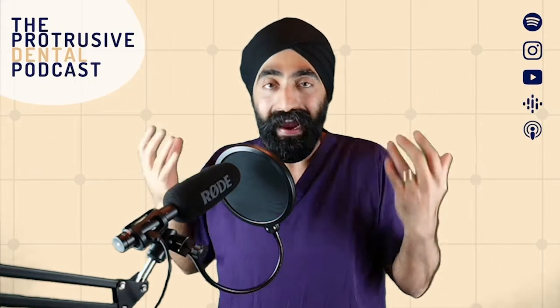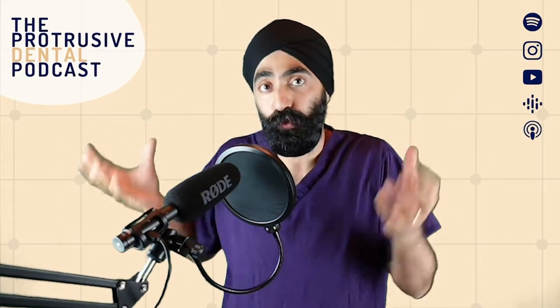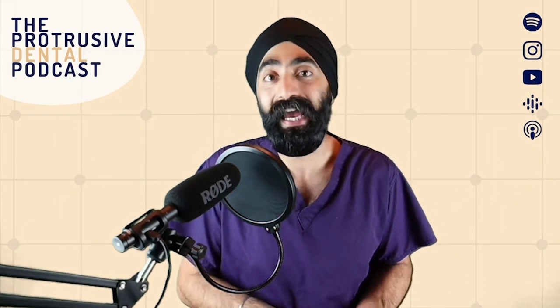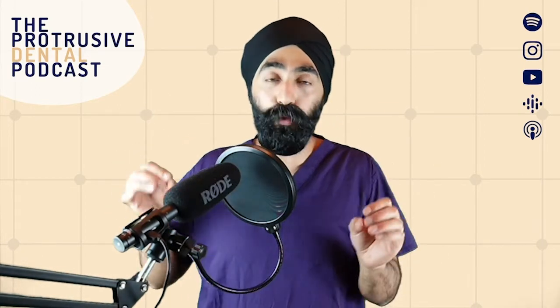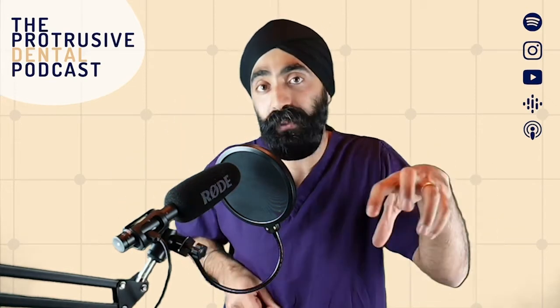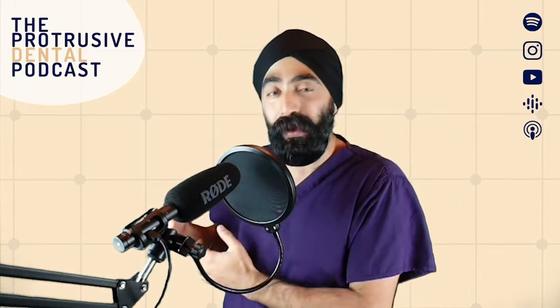Okay, so how can we make sure that this is as reliable and as predictable as possible? Well, that's why we use articulators, right? So we use articulators to mimic the TMJ and mimic the upper jaw and the lower jaw and the movement. So that's essentially why we use articulators, but we know that the best articulator is the TMJ. So now we have tools that supposedly help to improve the reliability or predictability of those movements on the articulator being the same as the patient.